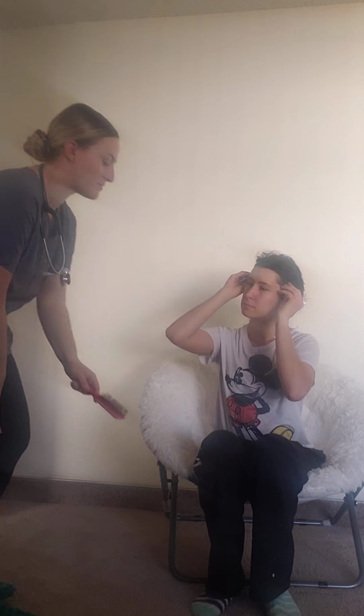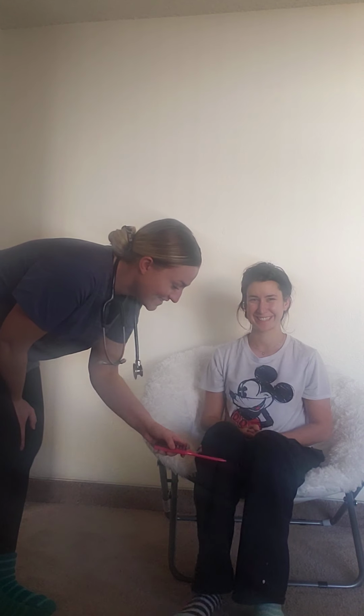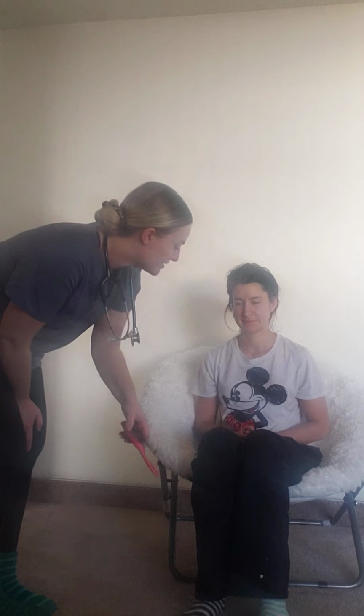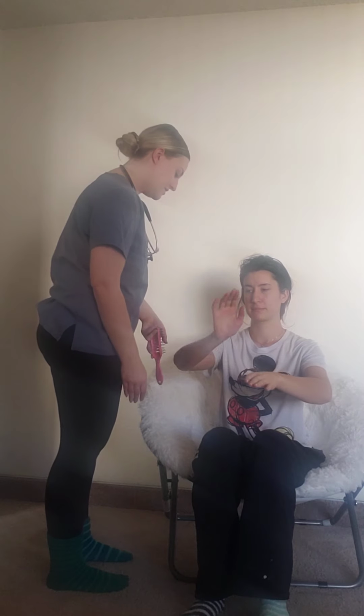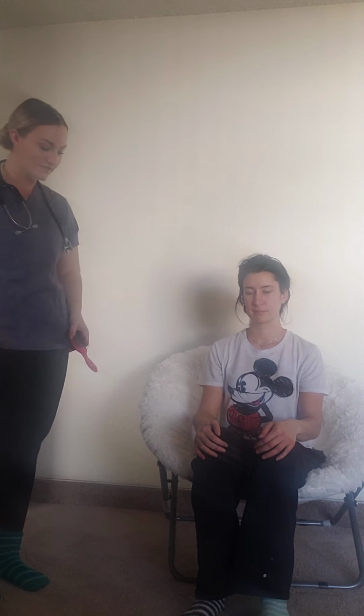So what I'm going to do is hit this against your knee, and we're just going to test your reflexes there. Okay. All right, normal active reflexes. Again. All right, normal active. Lift your arm up. So I'm just going to hit against here. Okay. All right, normal active reflexes for both her right arm, and right leg and left leg on her knees.